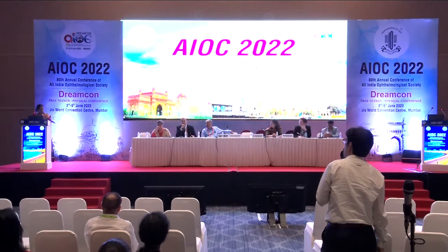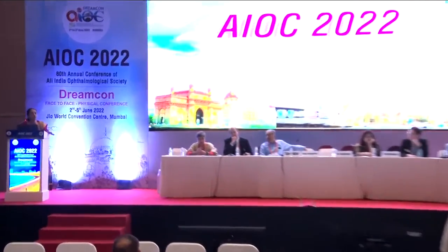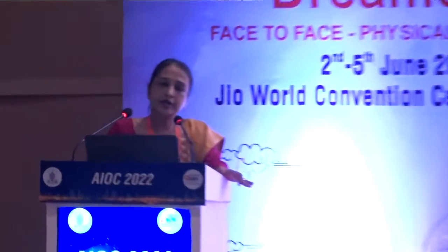CCT is a must. CCT is definitely a must. If it is showing only in OCT, and you know the patient is going to come for follow-up, and you feel the corneal thickness is okay, then you can definitely follow up the patient if you are in doubt. If there are no other risk factors, like a strong family history of glaucoma, or the patient having lost one eye because of this, then you can definitely follow up the patient.